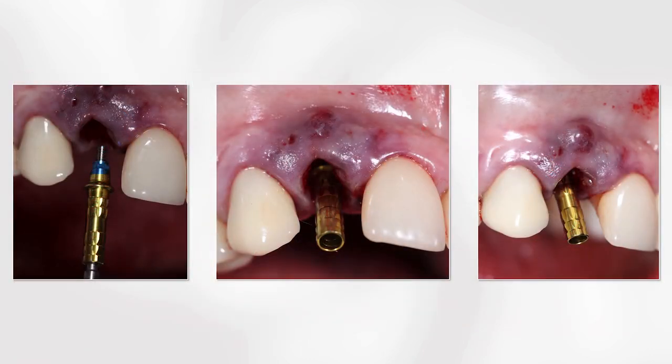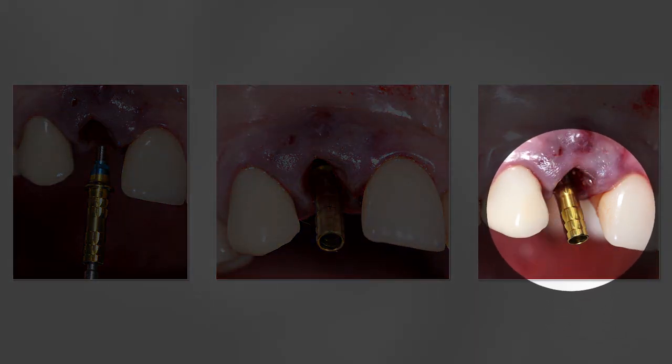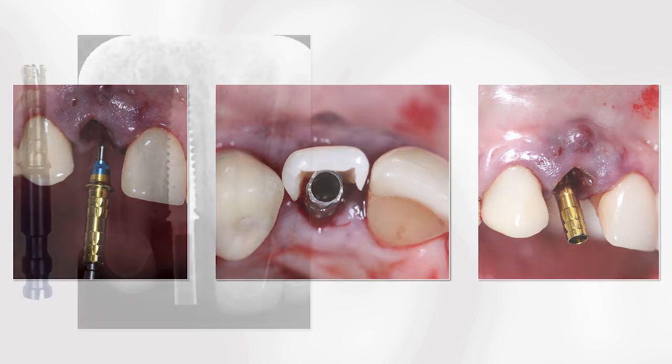That's why a provisional abutment was inserted here over the implant. And take a look at the position of the implant placed here. We are expecting to leave the little hole at the palatal aspect between the cingulum and the incisal edge. We bevel this abutment, we check the occlusion, and we check the veneer at the facial aspect of this abutment.